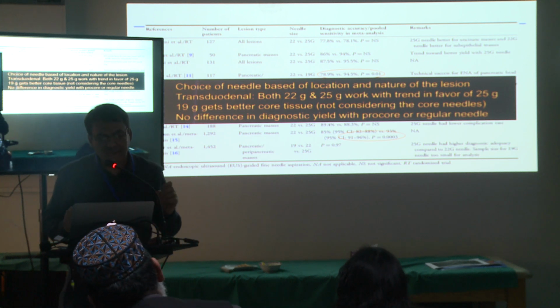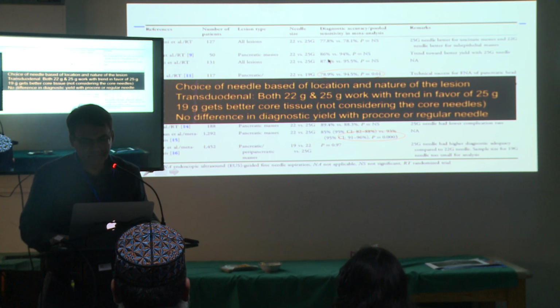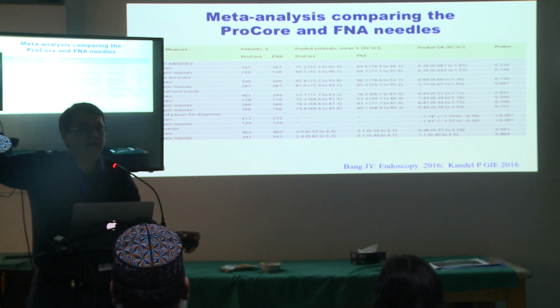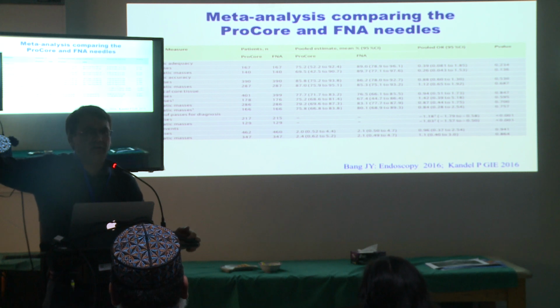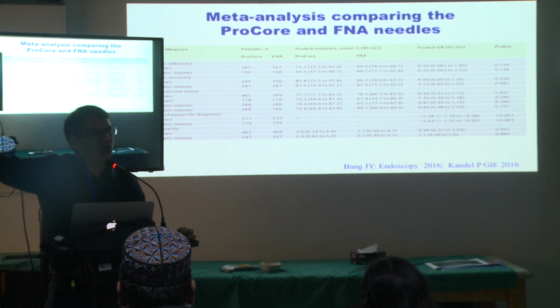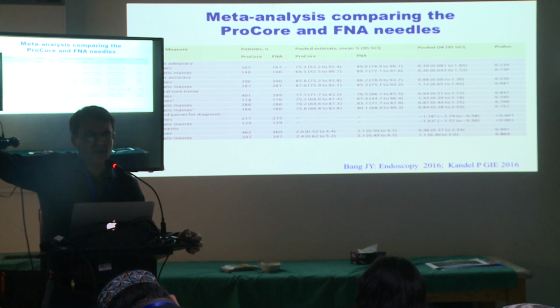Yes? With the biopsy FNBs, is the risk of pancreatitis more if you were to puncture the pancreas? So normal pancreas, I would assume theoretically yes, because you're going to be hitting the pancreas. If there's a lot of normal pancreatic tissue in between, I would not go with the core needle personally. I might be taking a whole side branch out with me and poking a hole there. If there's no normal tissue in between, then go with that. But for normal pancreas, I don't like doing that.